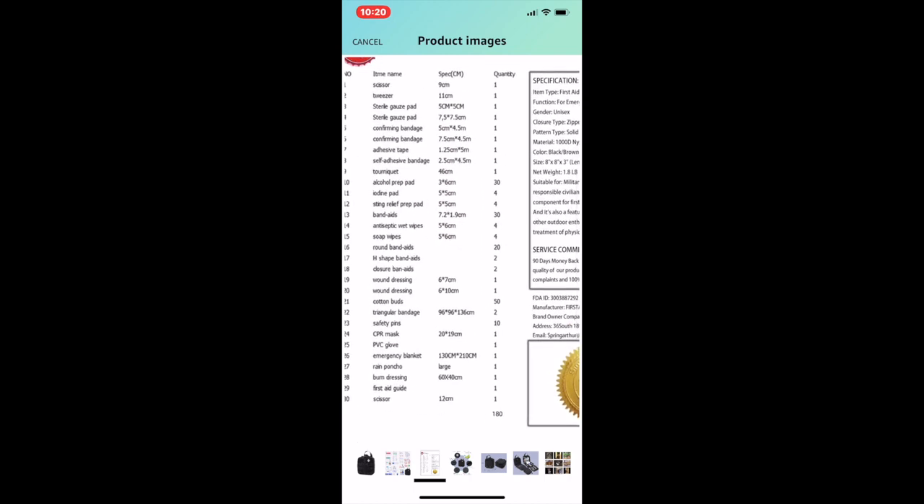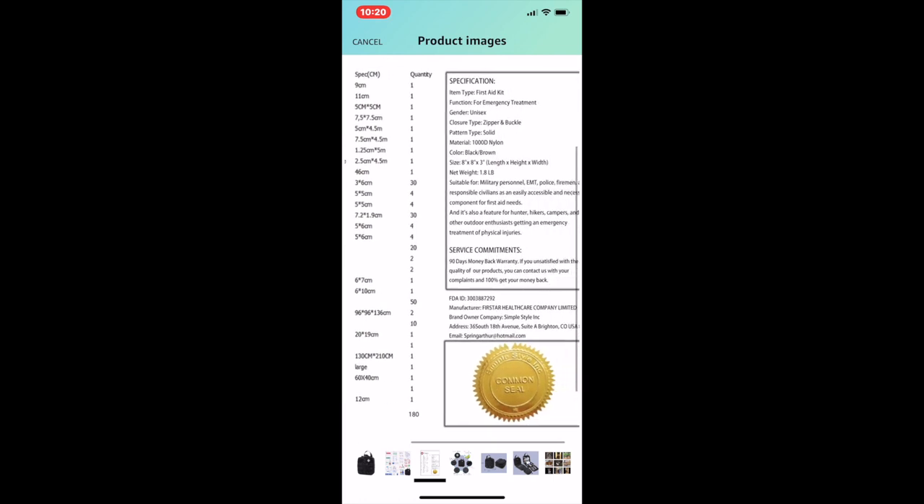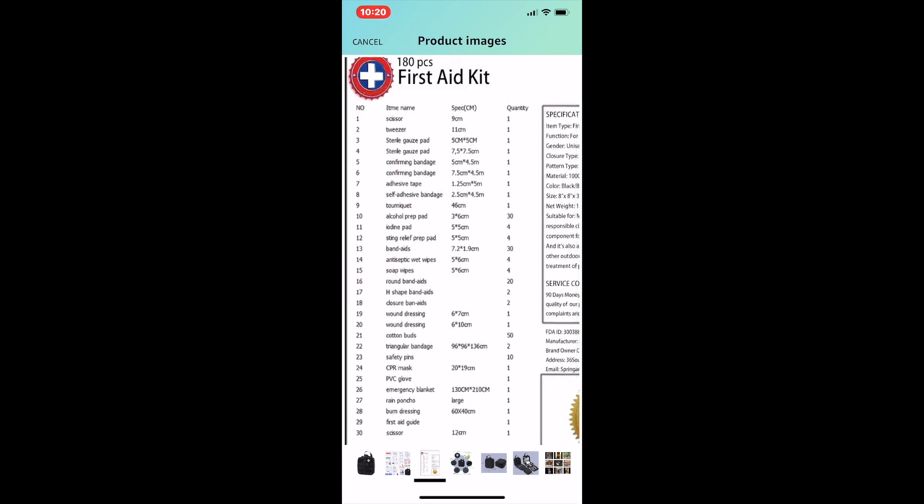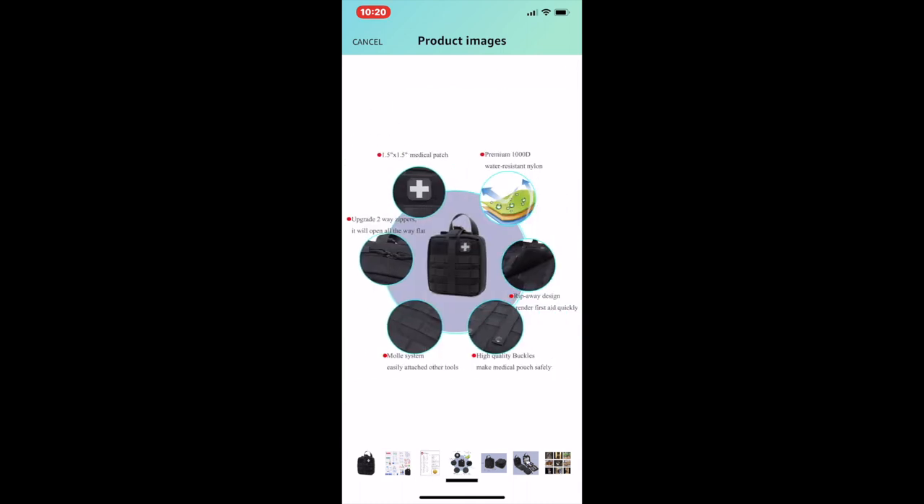With some items you actually get multiple: alcohol prep pads you get 30, band-aids you get 30, round band-aids you get 20, cotton buds you get 50, safety pins you get 10, antiseptic wet wipes you get four, soap wipes you get four, iodine pads you get four, sting relief prep pads you get four, and everything else looks like one of each.